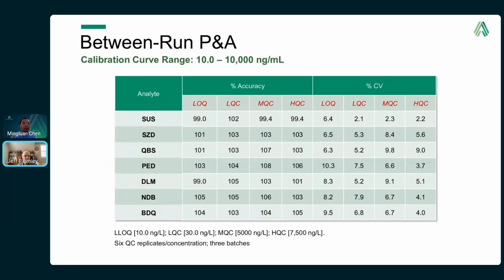So pre-treating the cellulose in the Capitainer B cards with 20 microliters of 1 molar ascorbic acid, drying for 24 hours, and then depositing 10 microliters of calibrators and QCs direct to substrate, we wanted to see how the assay would perform. And so the next few slides are simply the results of some of the method development stressing evaluations that we conducted.